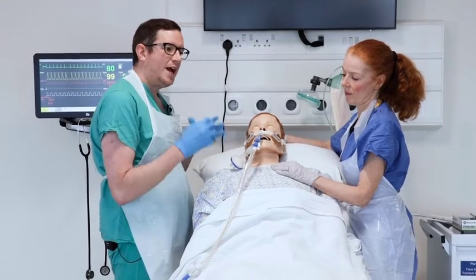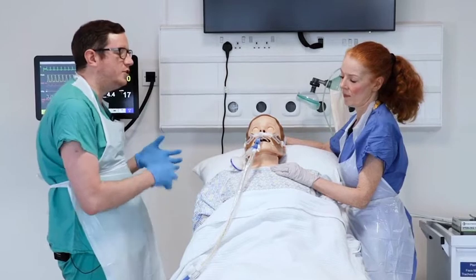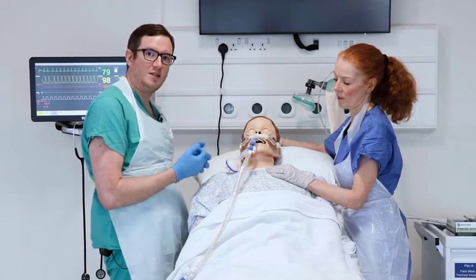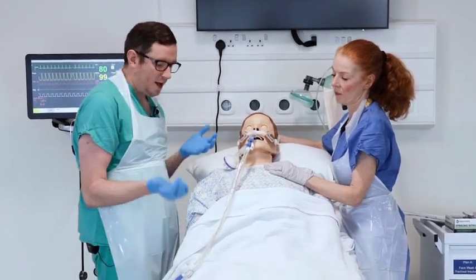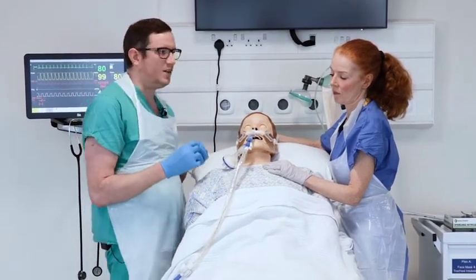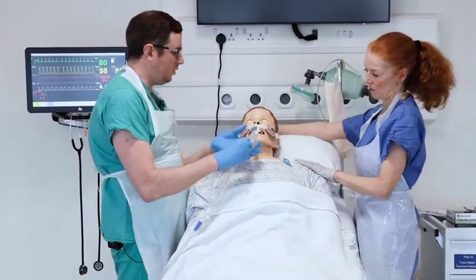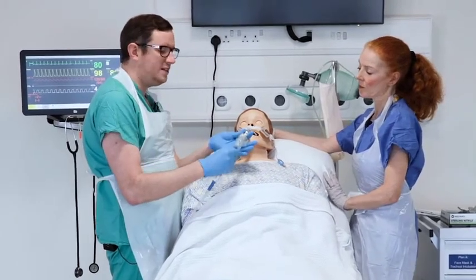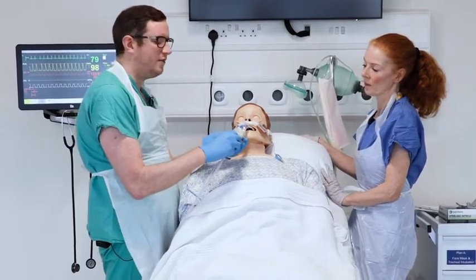To begin suctioning, first check the patient's oxygenation status and consider turning up oxygen to 100% for a short time before the procedure. Once satisfied the patient is oxygenating well, pass the suction catheter without applying suction. Slowly insert the catheter, watching that the black mark is passing the teeth with no obstruction, and advance it most of the way down to ensure you are at the back of the tube.